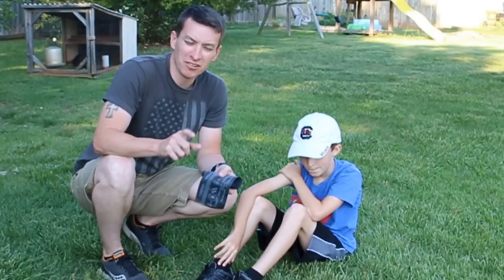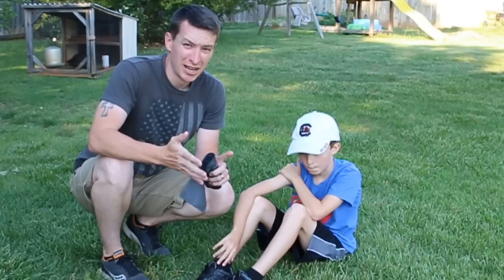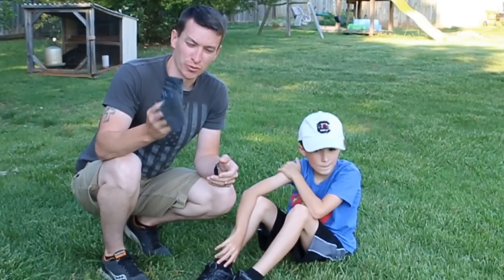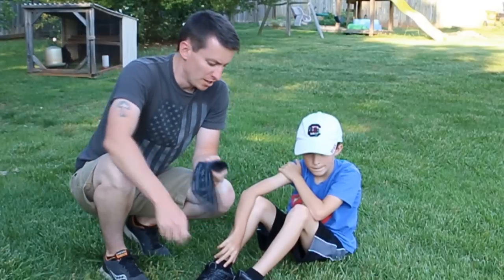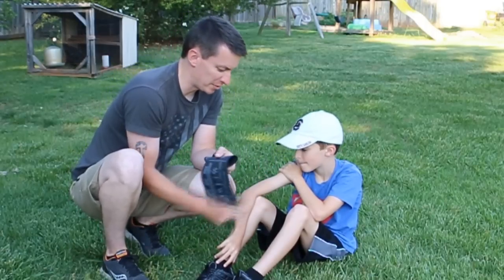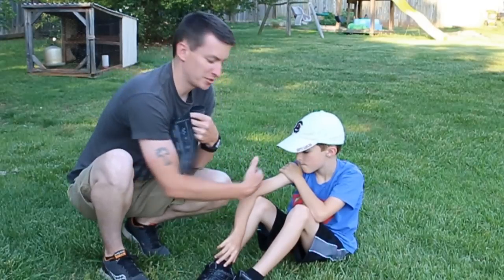This tourniquet works really well for buddy aid. It also works for kids and canines as well. For buddy aid, the SWAT-T tourniquet works really well. We're going to say he has an injury here that's squirting bright red blood — a lot of bleeding. You would expose it if you had time, cut it, rip it, whatever you need to expose the injury. Then the tourniquet goes towards the body.